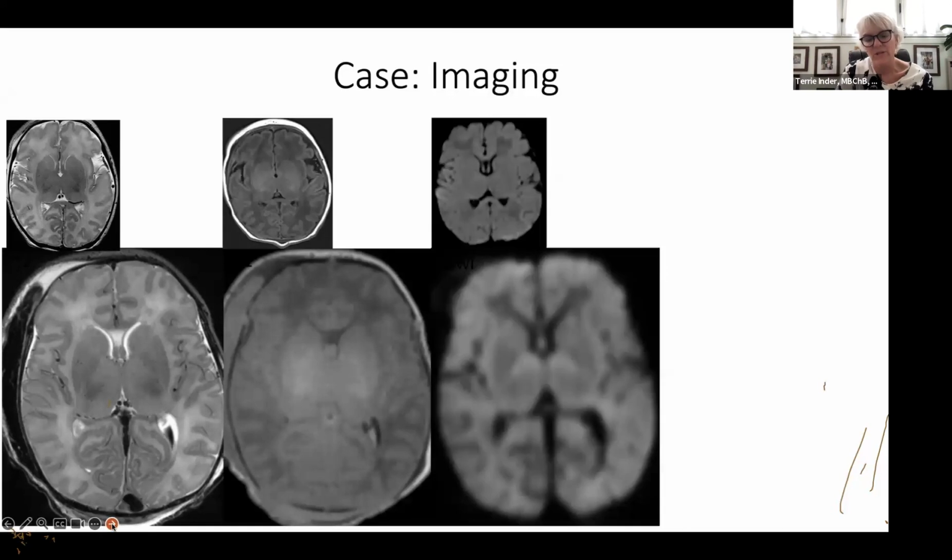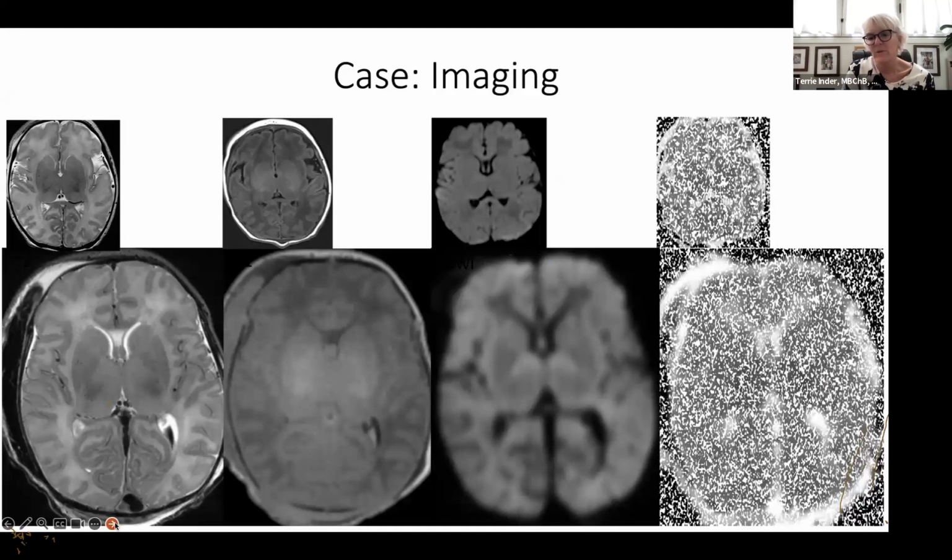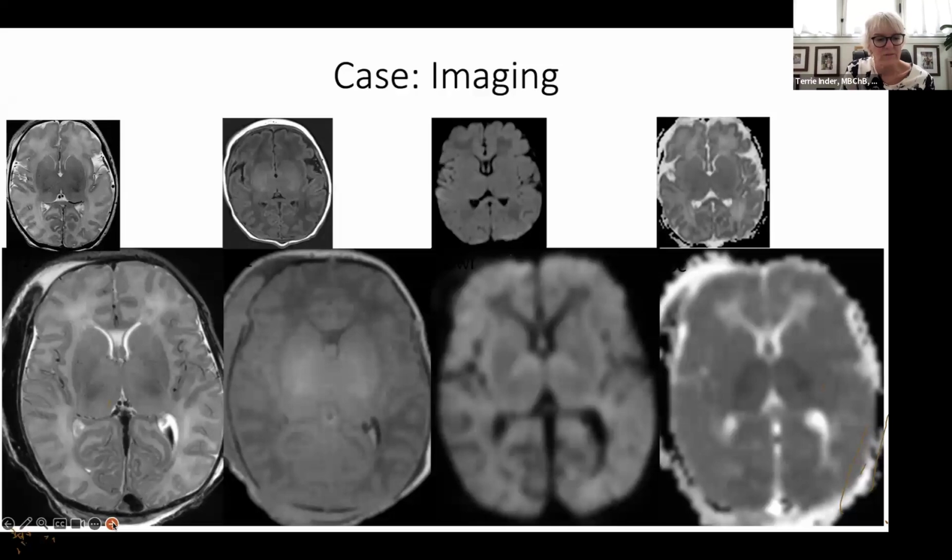But then go to the diffusion weighted imaging, and what you can now see above is a typical normal diffusion weighted image. And sometimes these images are almost mistaken because you look over it and you're like, oh, it all looks the same, so it must be okay. But actually, of course, this is a profoundly abnormal, elevated global ischemic injury. And you can see this when we also look at the restriction on the diffusion.